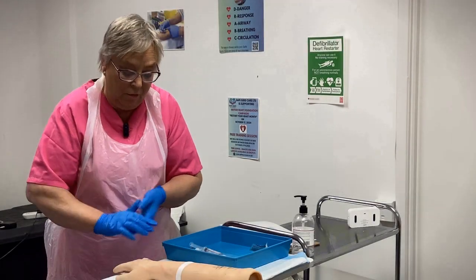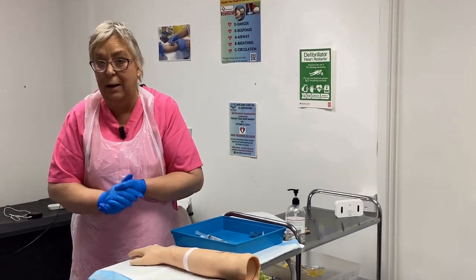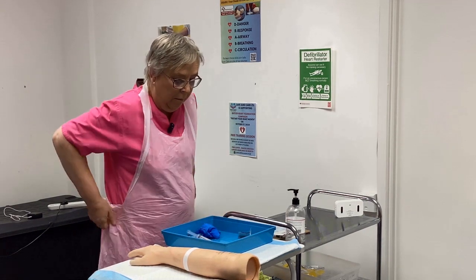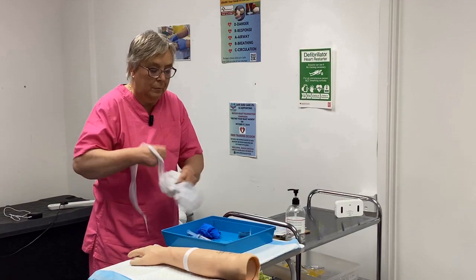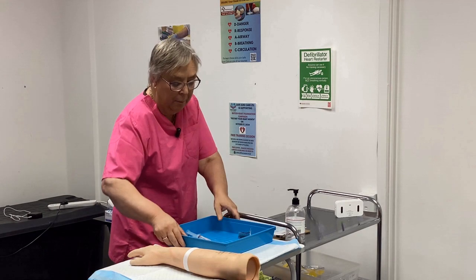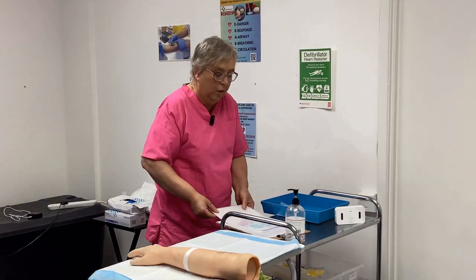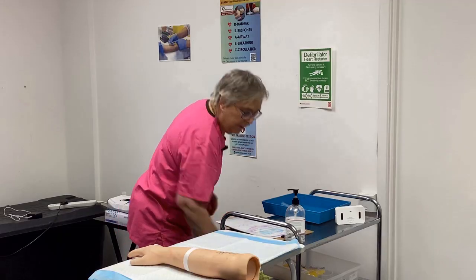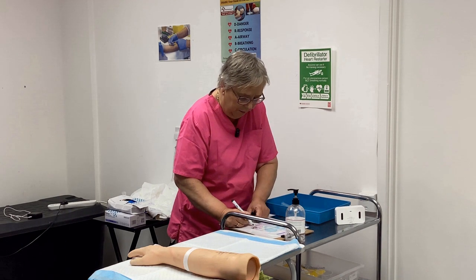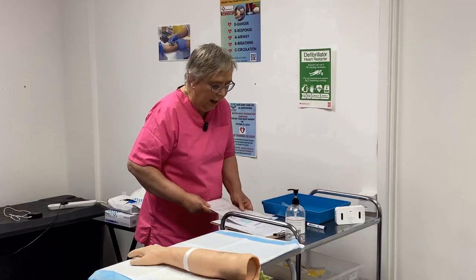Does it feel all right? Yeah. So that's comfortable. So I'm just going to go and get rid of my equipment. I'm going to go and sign my chart and then I'll come back to you. So I'm going to take this away. I'm going to take my gloves off and then take my apron off. My hands are clean. My yellow bag that I brought with me — get rid of any other equipment in the clinical waste bin. And then I'm going to sign my chart now that I've administered it, with my signature and today's date. The time is 1410. So that's all signed. Happy that the chart is completed correctly. And that's that administered.